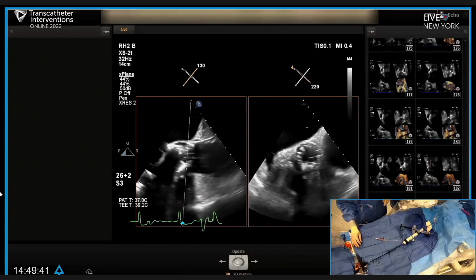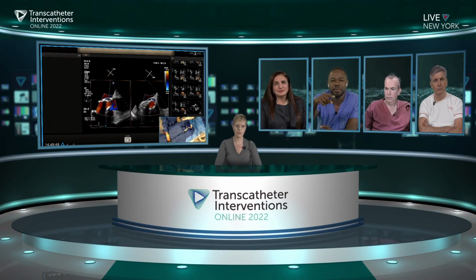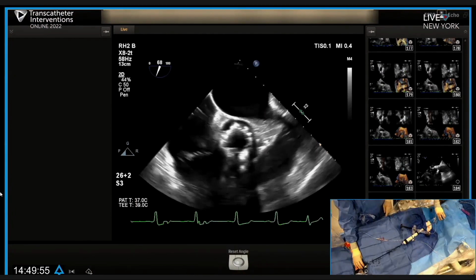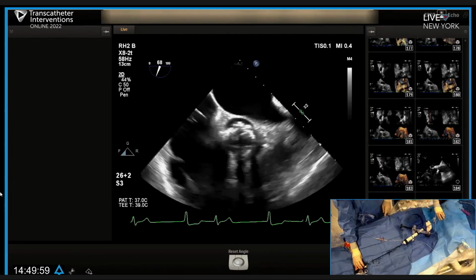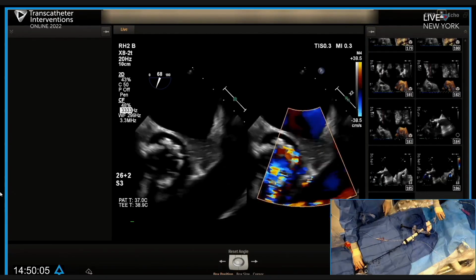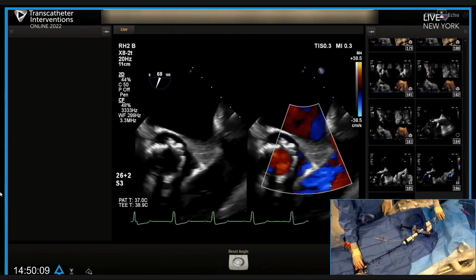So we've been trying to aim really high on these bicuspids. Yeah, just to highlight one educational point, because you just rotated the C-arm, and potentially you went closer to a cusp overlap projection. What is recommended nowadays for bicuspid, because you only have two cusps, and the most frequent phenotype is type 1 left to right, is what you see better in the RAO caudal projection.